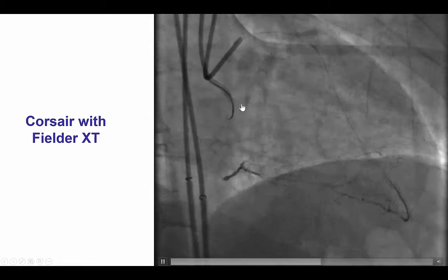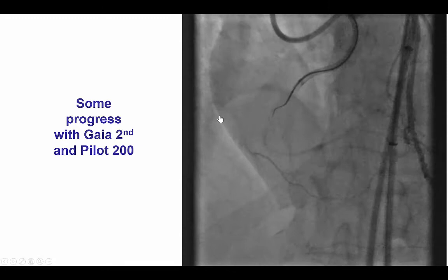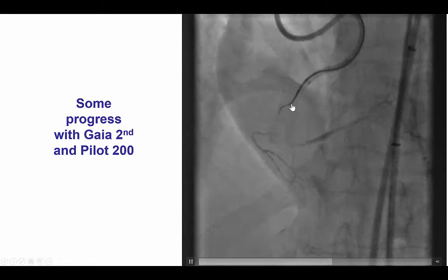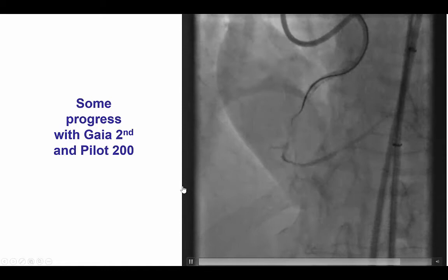A Corsair catheter was placed in the proximal right coronary artery and attempts were made to cross with the Fielder XT guide wire. There was some progress after switching to a Gaia Second, moving along the course of the vessel. However, we were unable to advance any further, although we were getting close to the distal cap.